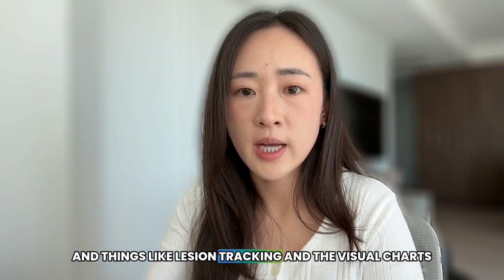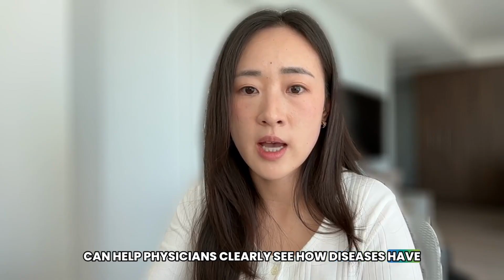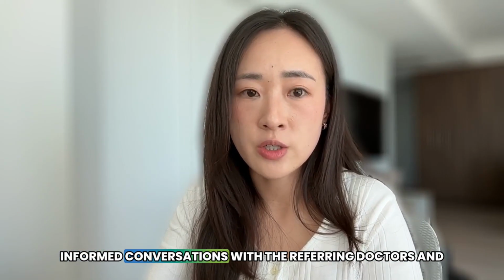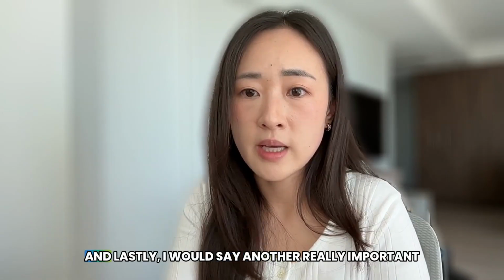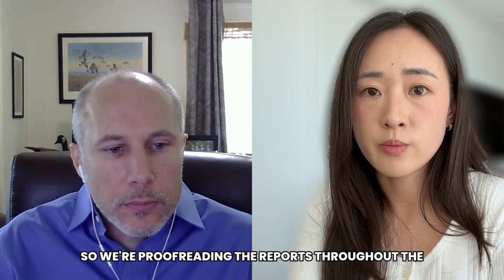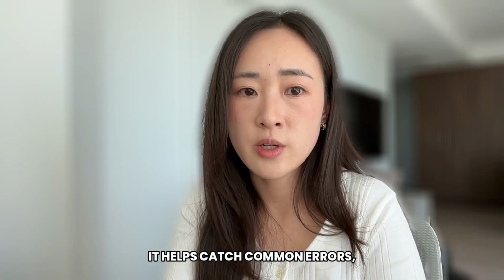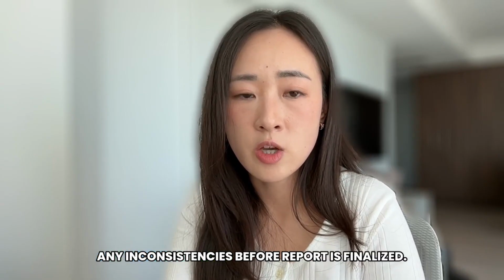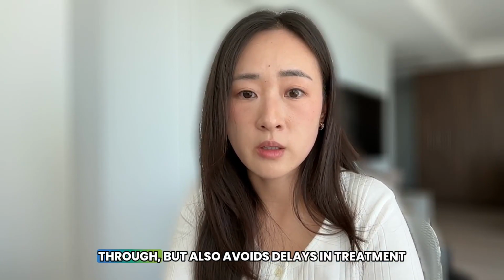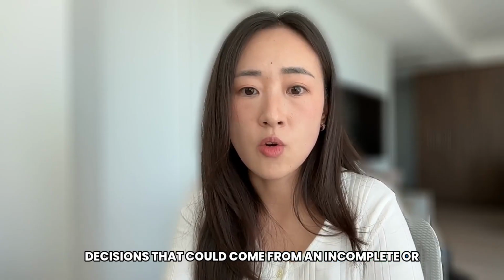And things like lesion tracking and the visual charts can help physicians clearly see how diseases have changed, which supports better treatment planning and more informed conversations with the referring doctors and patients. And lastly, I would say another really important piece is AI powered proofreading. So we're proofreading the reports throughout the process of report generation. It helps catch common errors and any inconsistencies before the report is finalized. So that not just prevents mistakes from slipping through, but also avoids delays in treatment decisions that could come from an incomplete or corrected report.